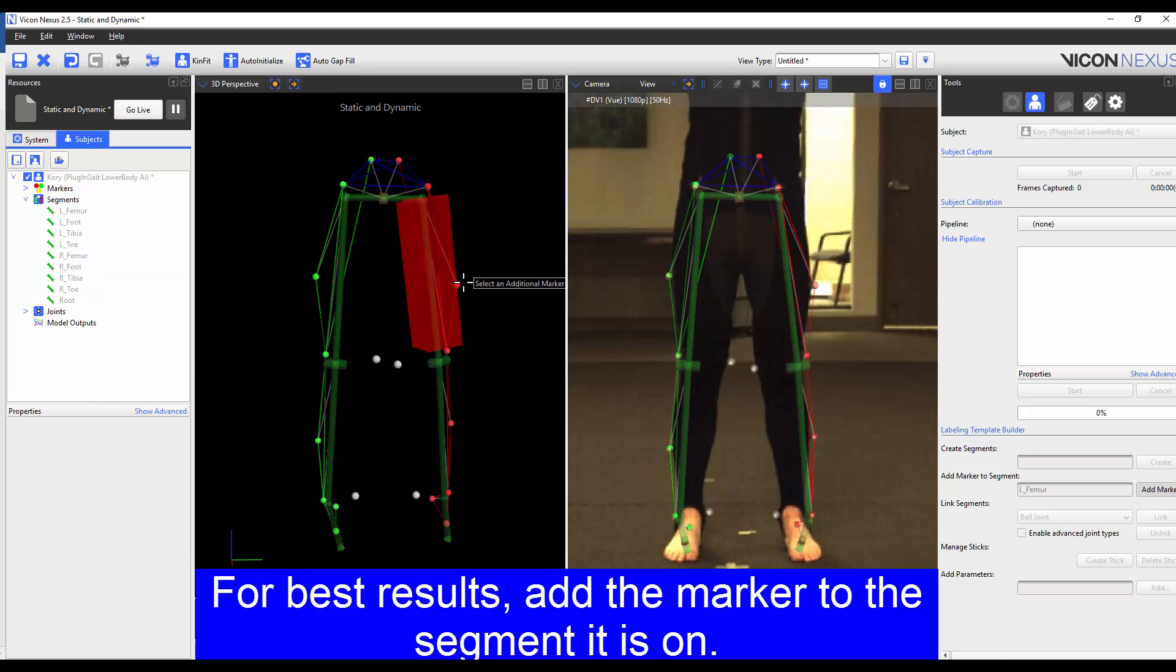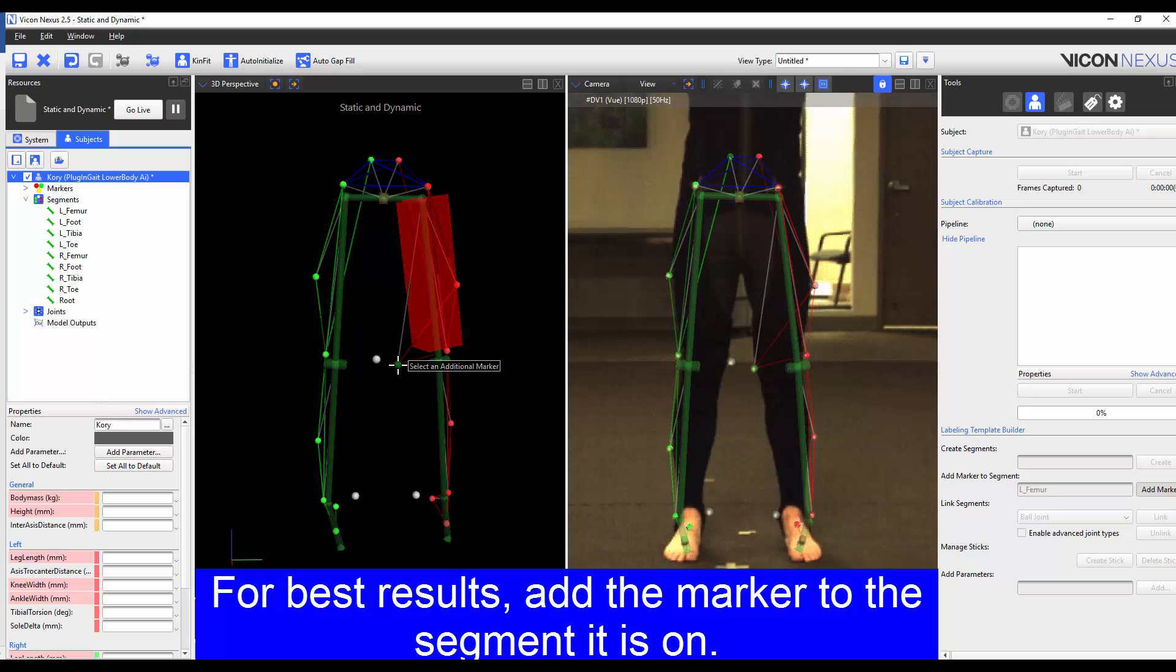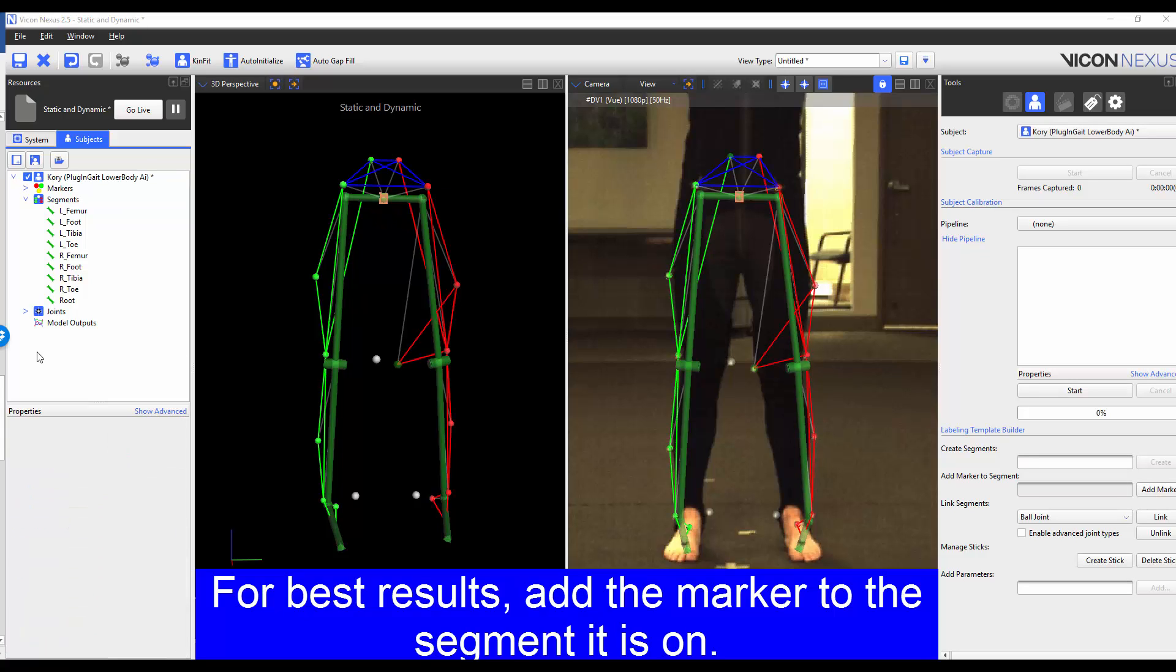This then prompts me to choose the additional marker and I choose the corresponding marker. To finish the process for this marker, I press Add Marker again. I'm going to be repeating the process for the right medial knee marker. However, in this example, I'm going to choose the right femur segment from the segment list.